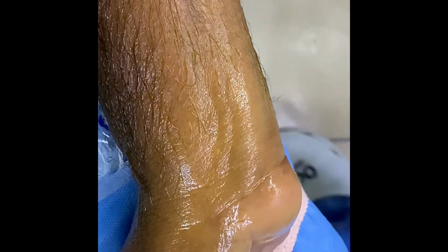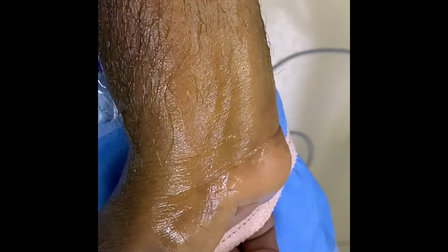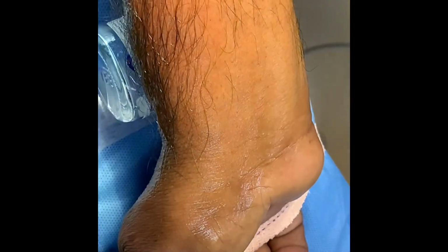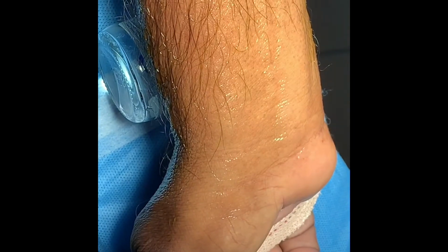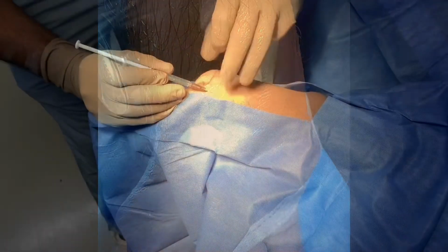Now, as all of you would know, the cannula has a puncturing needle and a cannula proper. There is a small millimeter difference between these two, and our aim in any of these arterial line insertions would be that the needle and the cannula should be completely within the artery for a proper and successful cannulation. Now, when we puncture the artery, we see a backflow of blood within the hub of the cannula, and that shows that the artery has been punctured.